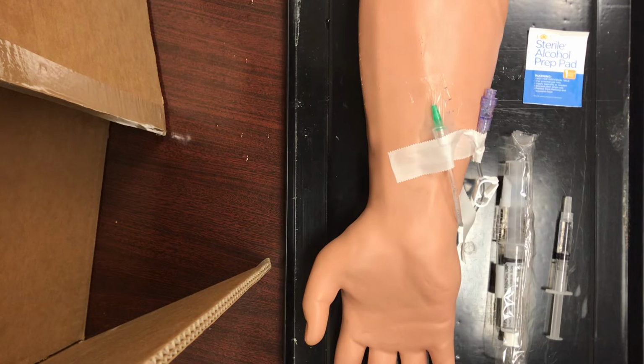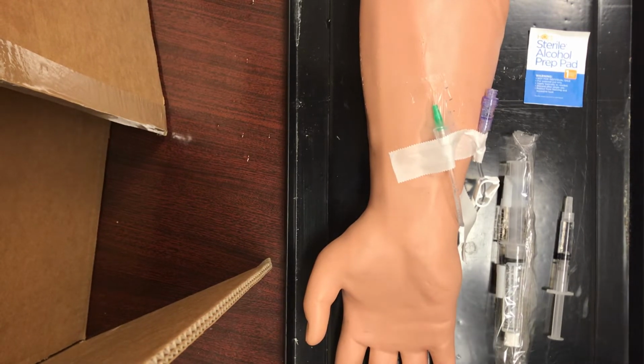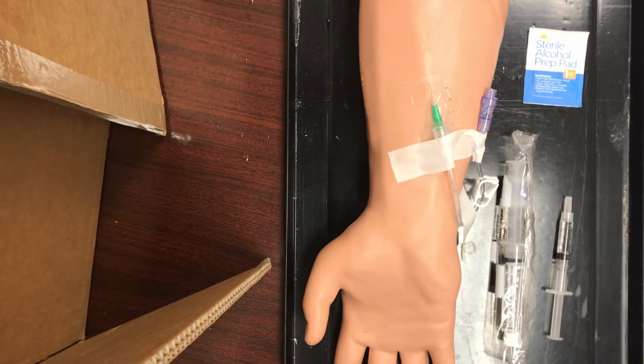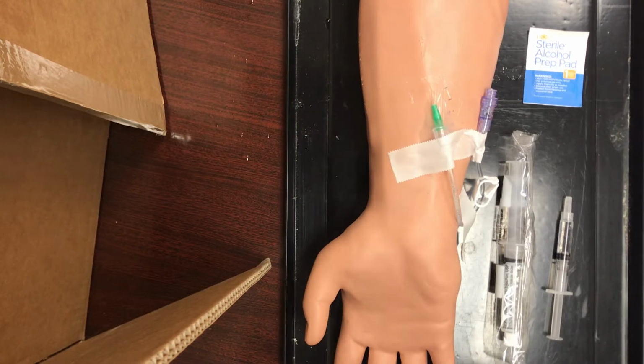The next thing is to check compatibility. Checking compatibility is good because we want to make sure that if we need to dilute the medication, or if a patient's getting a medication with another primary infusion, or if they're getting an antibiotic, it is compatible with whatever else we're giving. Again, we've checked the allergies, so that's the A. R would be the rate at which we're going to give the medication.